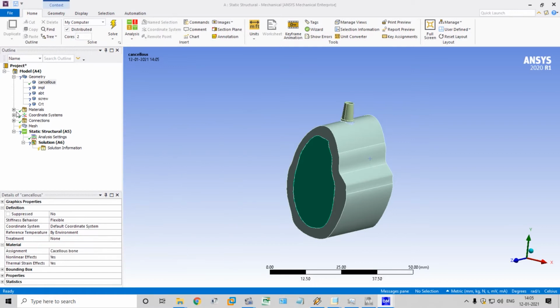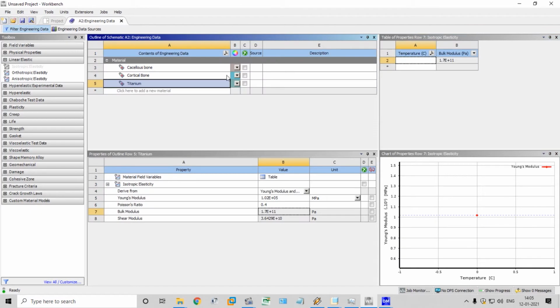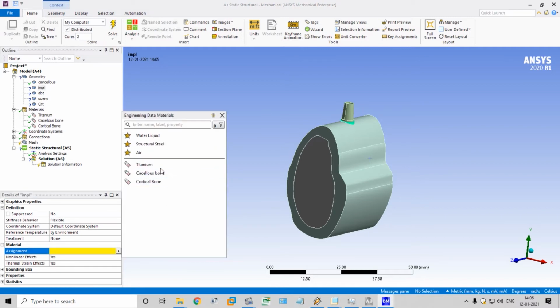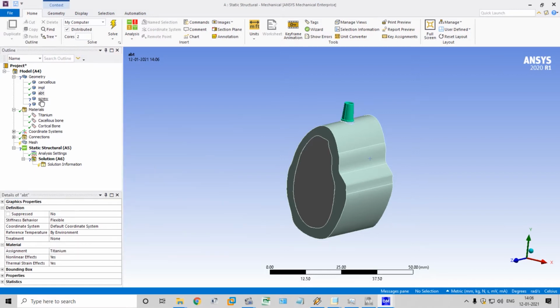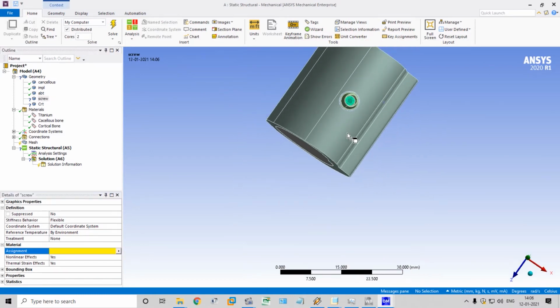Cancellous bone: what we have entered here, that will be directly transferred to this. Cancellous bone mode, implant will be titanium alloy, abutment, titanium screw. Once again check it out.